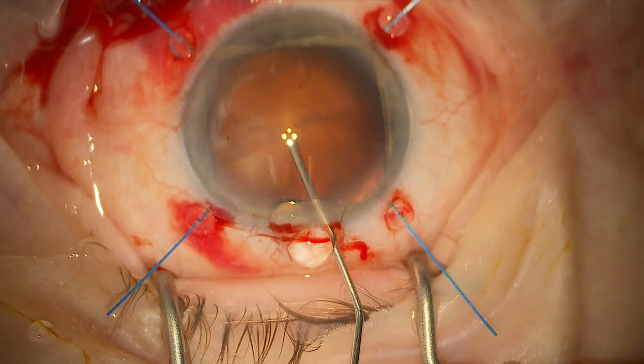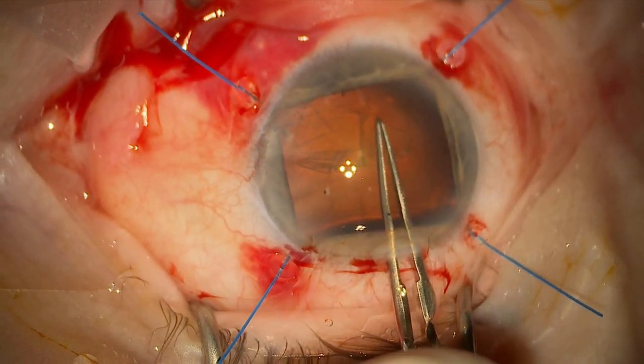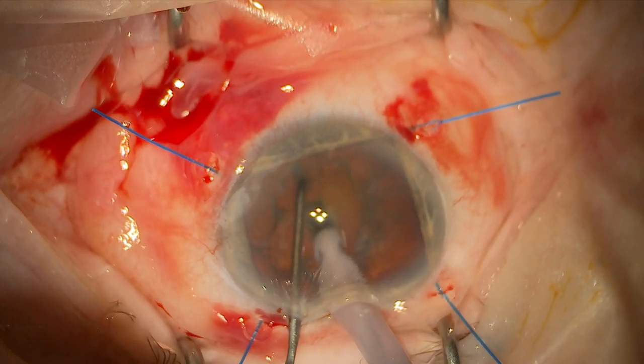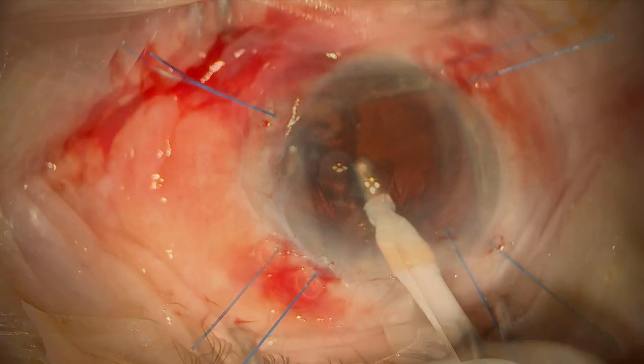Now we just proceed with the normal cataract surgery — going to my capsulorexis here, then using a primary chop to break up the nucleus, cortex removal, and now inserting the intraocular lens.